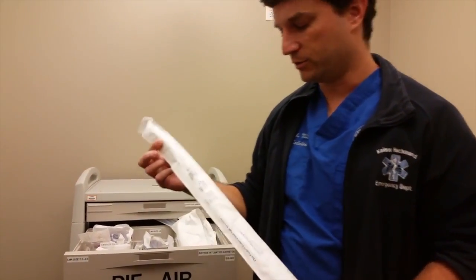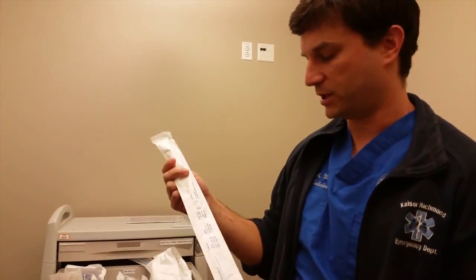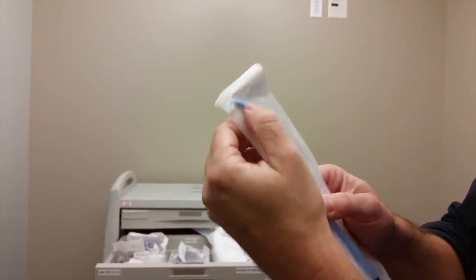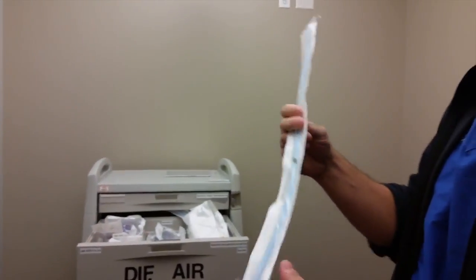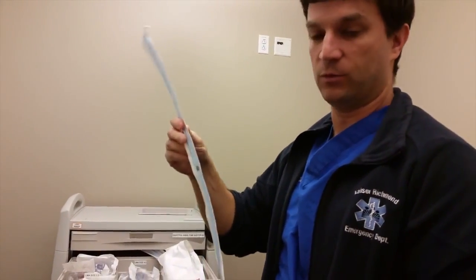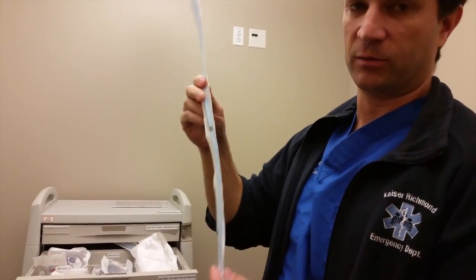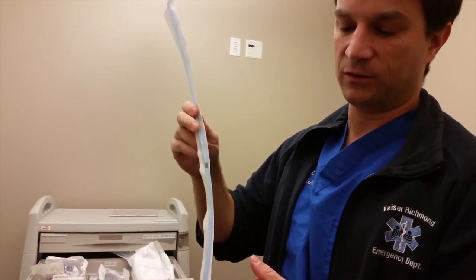Often the next step that we'll use in that type of scenario where you've missed a couple times would be using a bougie. And a bougie has a coudé tip on it, just like the catheter, where it's got a little inflection forward. That's a little rigid there. The idea here is that you use this as a stylet or a guide wire of sorts. And being smaller than an endotracheal tube, oftentimes if you have some glottic narrowing or subglottic stenosis or whatever the case may be that you can't get the tube in, you can pass this into the glottis.